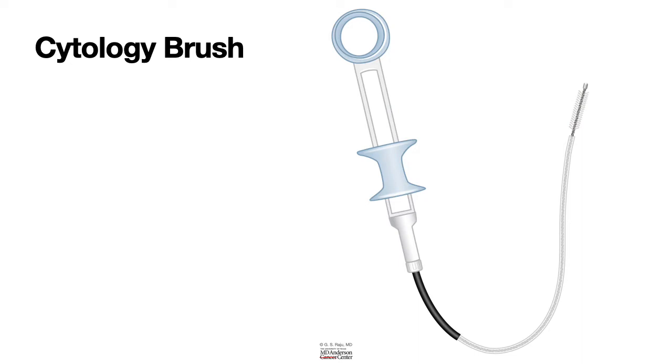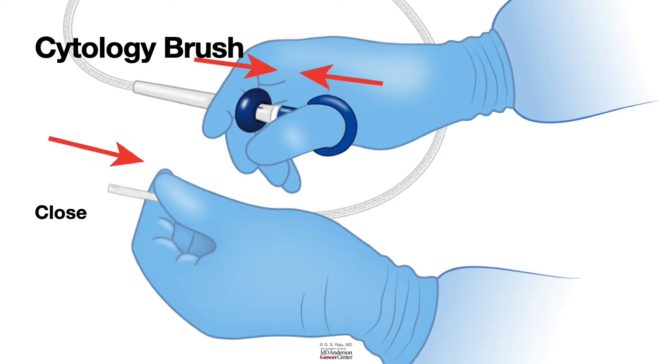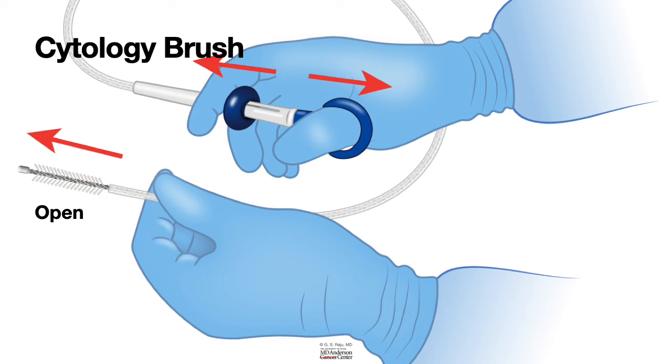The handle has a thumb ring, and the slider will allow you to hold in between the forefinger and the middle finger. So let us learn about how to operate a cytology brush. When you take the brush out of the plastic envelope or paper envelope, it is usually in a closed position. When you put your finger in the thumb ring and hold the slider between the forefinger and the middle finger and close your grip, the cytology brush is enclosed in that plastic outer sheath. When you open your hand and push the slider forwards, the brush comes out. You could say brush open position.